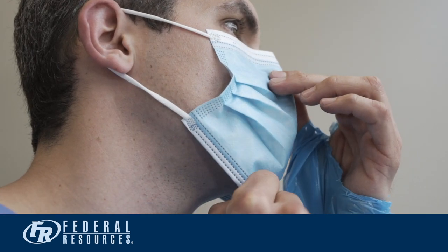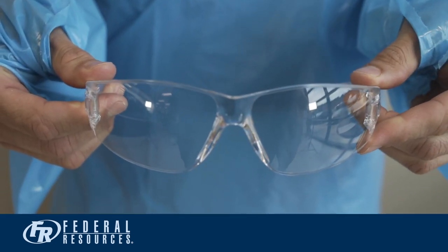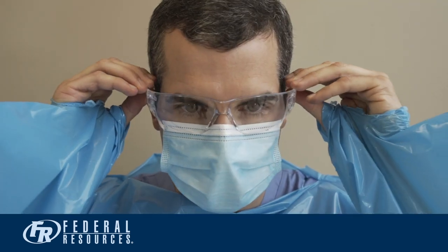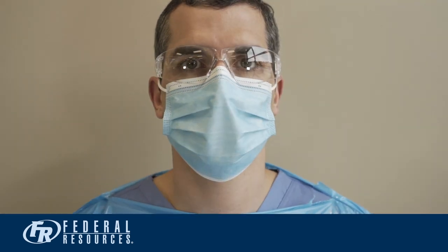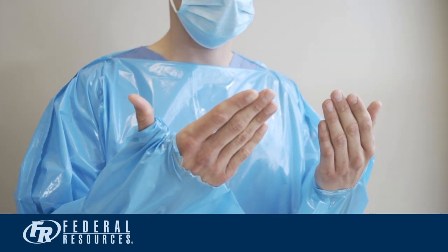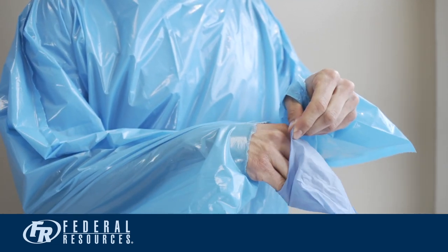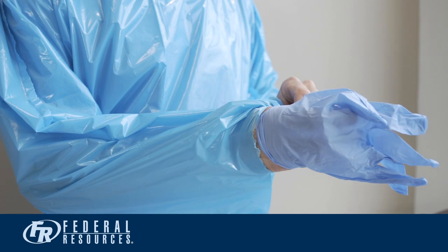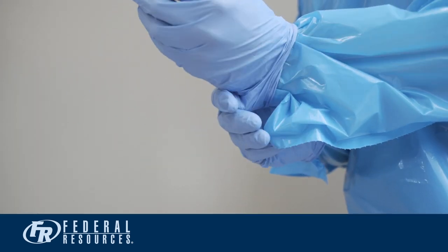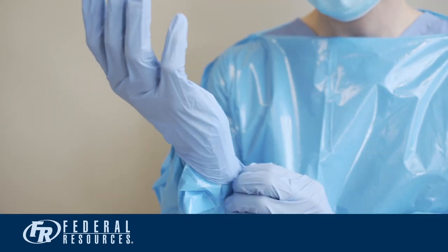Ensure your mask reaches down to below your chin. The next step is to put on your eye protection. If you wear glasses, your eye protection will go over your glasses. You are now ready to put on your gloves. Prior to putting on your gloves, ensure your thumbs are inserted in the thumb sleeve holes. Put your gloves on as you would normally. The key is to pull the glove above the cuff of your sleeve, ensuring there is no skin showing between your glove and the gown.